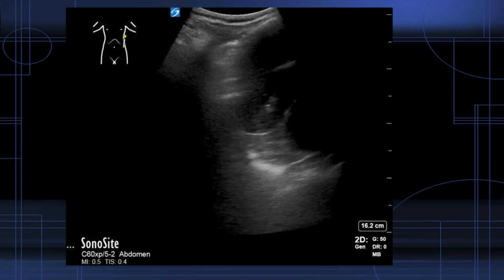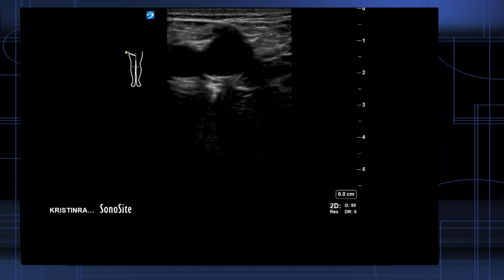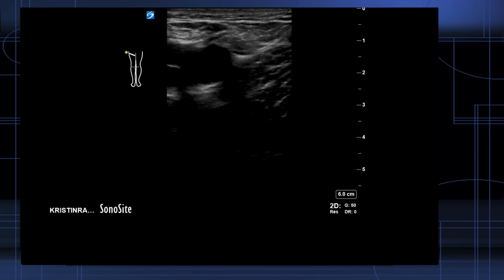Usually at this point, you're done. In 2 situations, you'll have to take just one more step. You may have to look for a lung point in pneumothorax. And if the lungs look entirely normal, then evaluate the likelihood of pulmonary embolism by scanning for DVT. This is actually really quite simple and short.